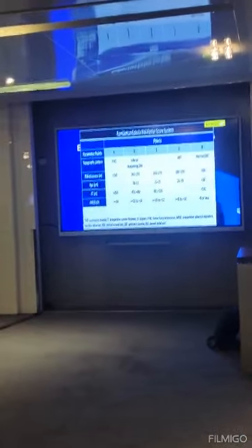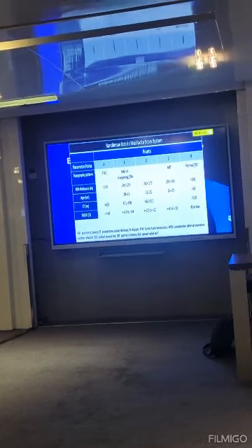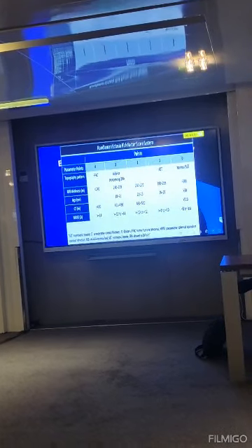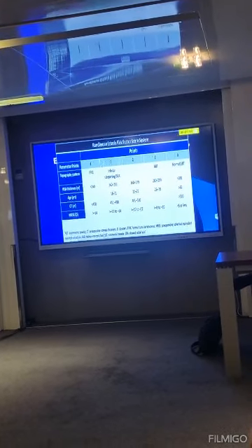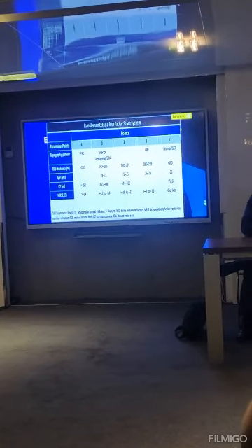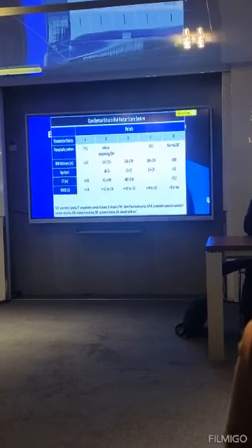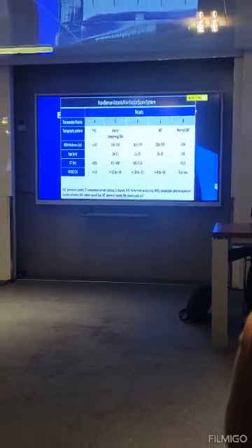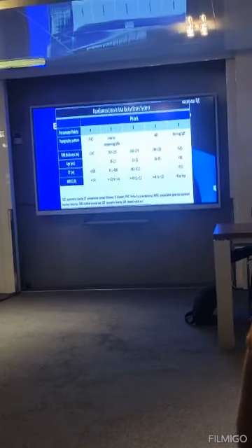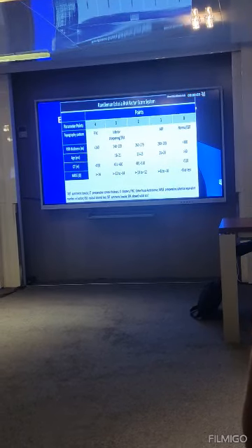The Randleman ectasia scoring system is not commonly used nowadays, but it can be used as a general guide. It takes into account the topography pattern, the residual stromal thickness, age, corneal thickness, and mean manifest refraction spherical equivalent. Any high value takes a high number like 4, a low value takes 0. We take all of these factors and sum them to calculate the risk score. Topography pattern: if it's forme fruste keratoconus, it gives 4. If it's normal, it gives 0.